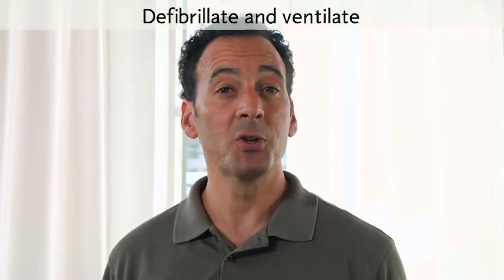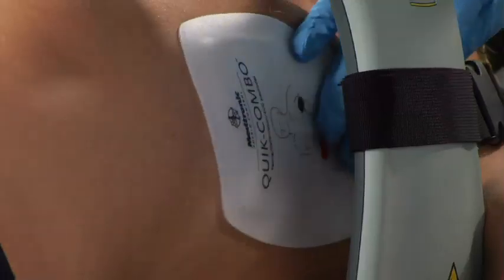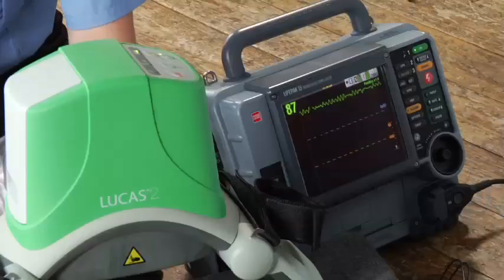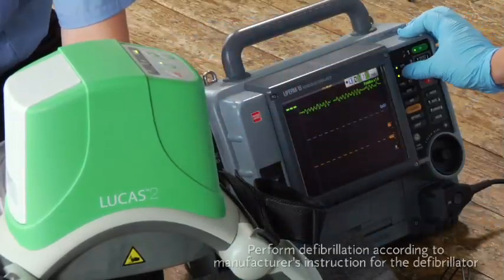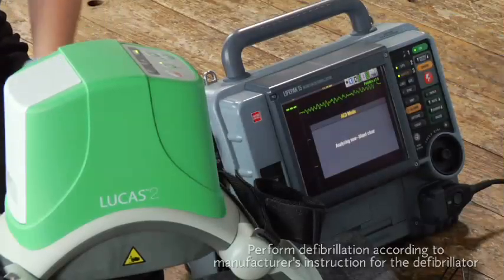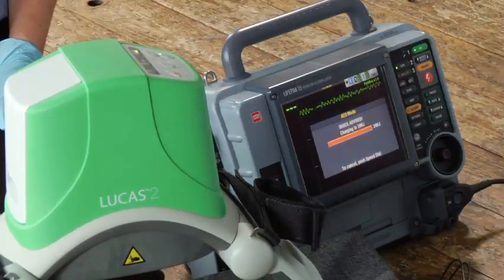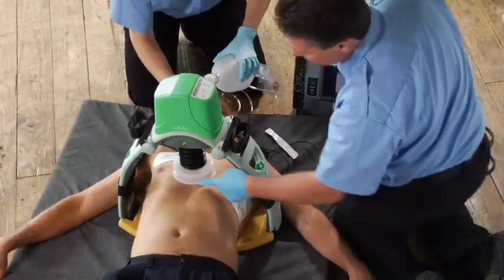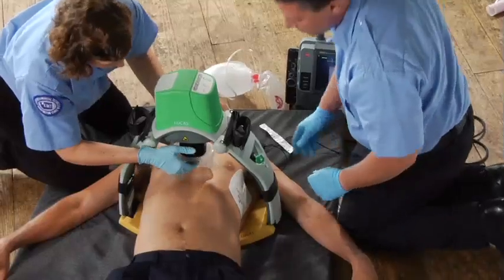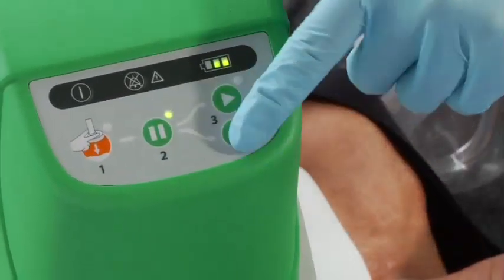You can defibrillate a patient without removing Lucas. Make sure defibrillation pads are adequately adhered to the patient's skin and no pads or wires are under the suction cup. If the patient already has pads on, you might need to replace or reorient them. During a rhythm check or AED analysis, push the pause button to stop compressions and make the interruption as short as possible. Use your defibrillator according to its manufacturer's instructions and your protocols. After the shock is delivered, verify the suction cup hasn't moved, readjust if necessary, then push active to resume compressions.